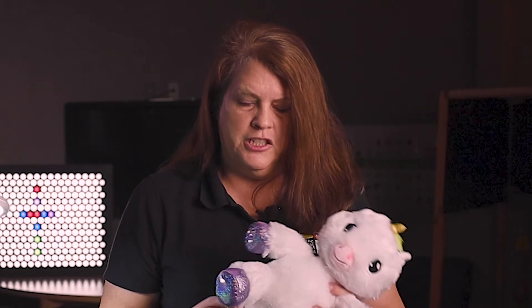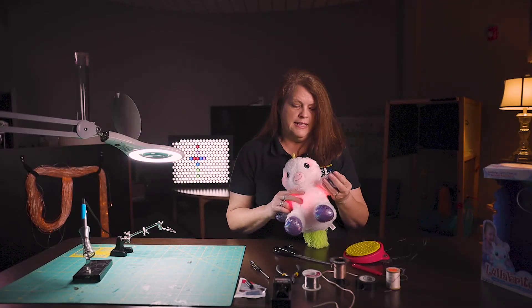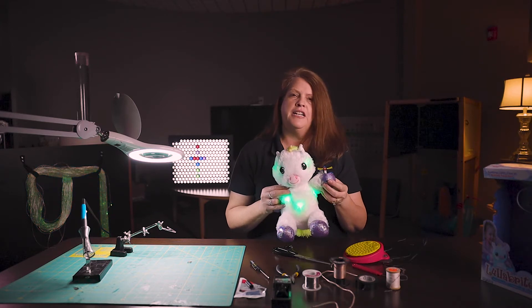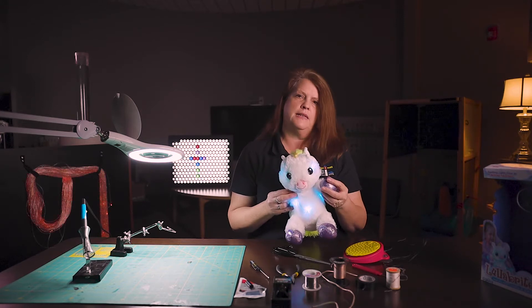The first thing you're going to want to do is make sure that your toy works. Make sure you have the batteries in place and that it's on — that's just helpful so you know how the toy works before you even adapt it. I'm going to push its hand here, and when you push it again it turns it off. So this is an on/off switch — that's what it's telling us.